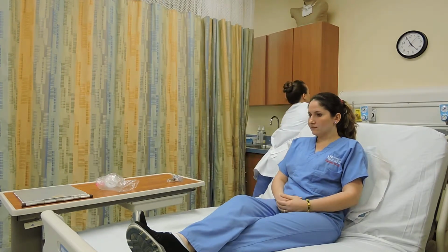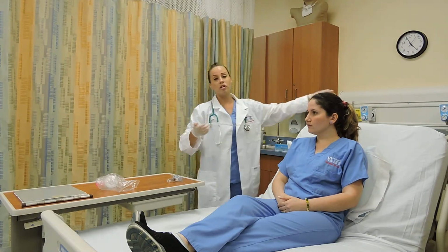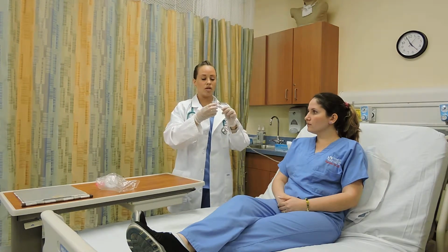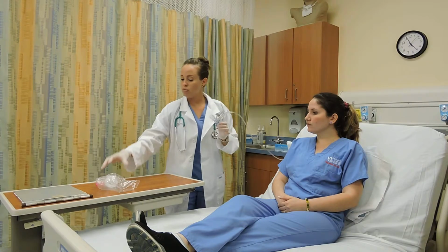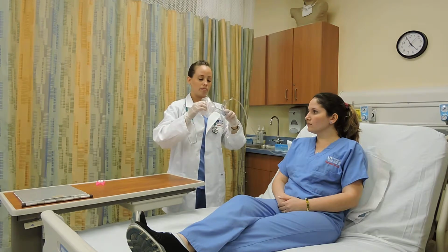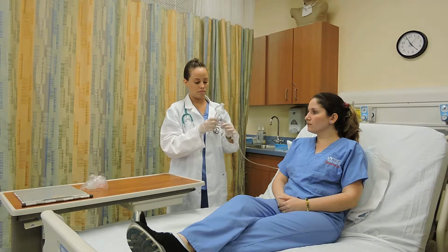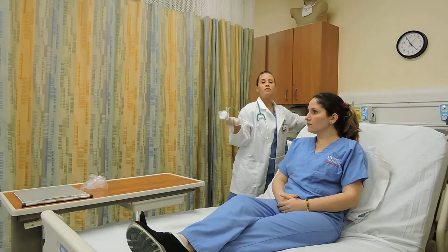It can either be oxygen or air, because this therapy is basically more an exhalation. And the other end, I'm going to connect it to the equipment. I'm going to attach my mouthpiece or filter to the equipment, and I'm going to set up my flow meter at 5 liters per minute.